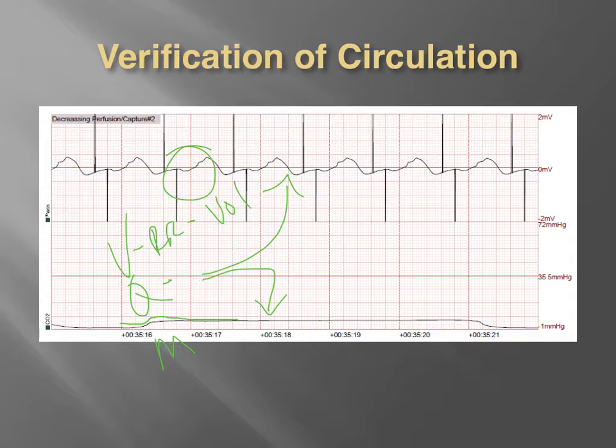Metabolism, blood glucose checks, things of that nature are going to help weigh the situation and find out if we do have some other issues such as ketoacidosis that may be causing this number to further drop. Because if we have some type of metabolic acidosis, this end tidal waveform is going to be very low as well, and our numbers are going to be very low. So it could be contributing to this problem, but most likely we have a perfusion issue, if not some other type of underlying issue of perfusion such as sepsis or something like that.